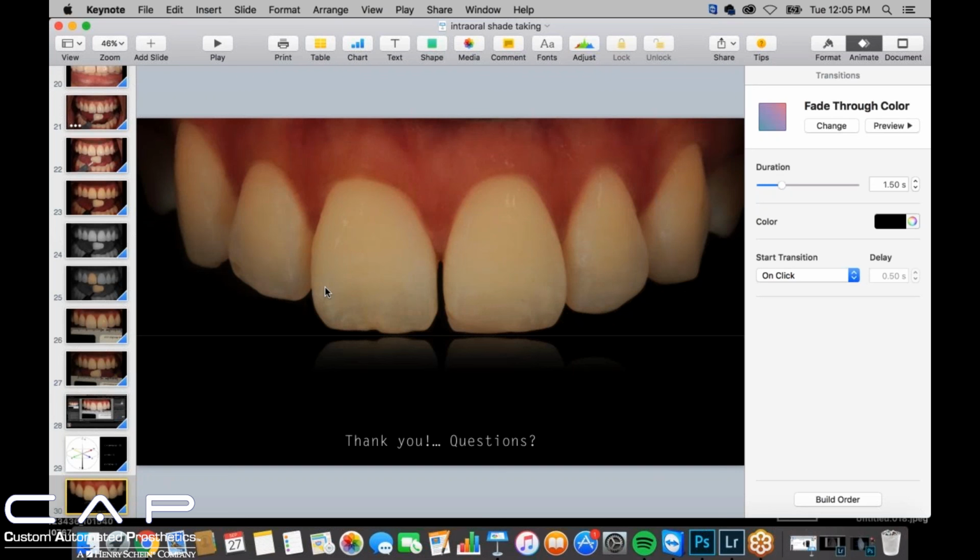And they've reformulated it so it's not poisonous to your body, which is a good thing. Basically, you take your dry ceramic, and if there's any pigment added to it, like a pink or an orange, you burn that out, you put it on a tray, you burn it out dry at a fairly low temperature, and you mix this. It's like a buildup liquid. It's almost like a stain liquid, actually.